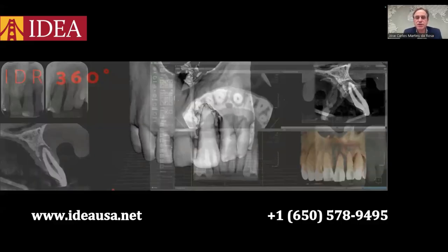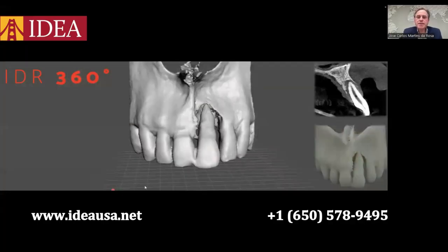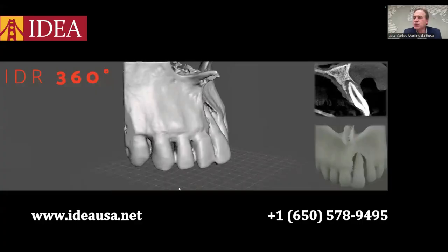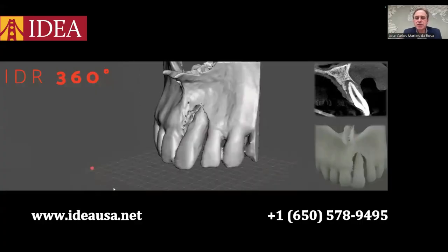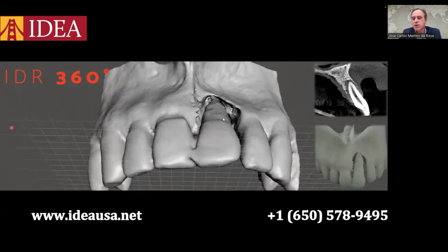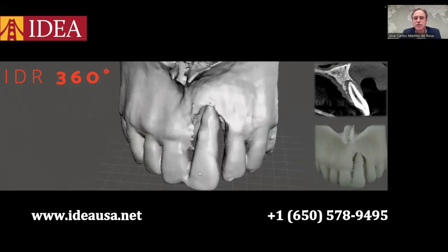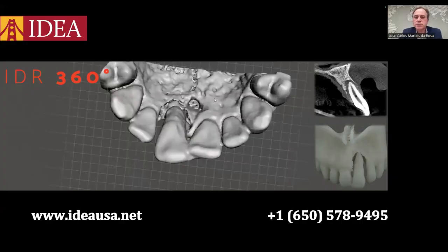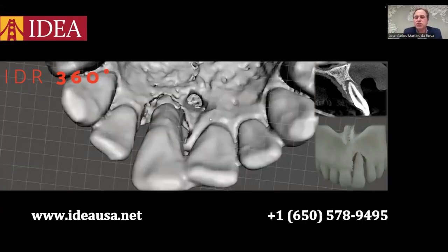You see through this 3D image the big challenge that we may face. And how can we treat this case? It was missing completely the buccal wall, and we also lost the crestal bone between central and lateral incisor. And have a look at the palatal aspect. We have no bone. And how can we manage this?